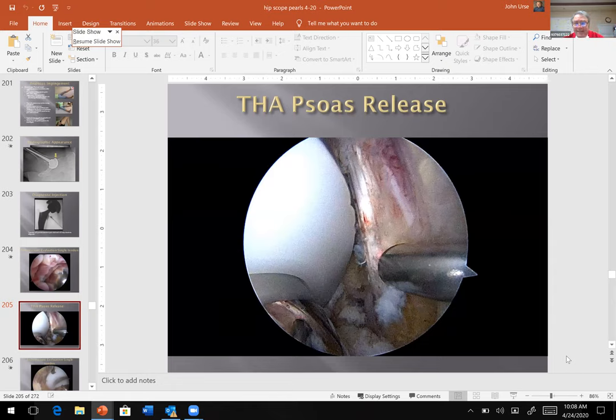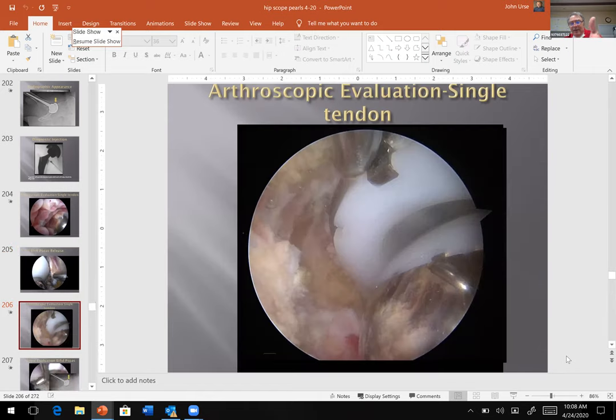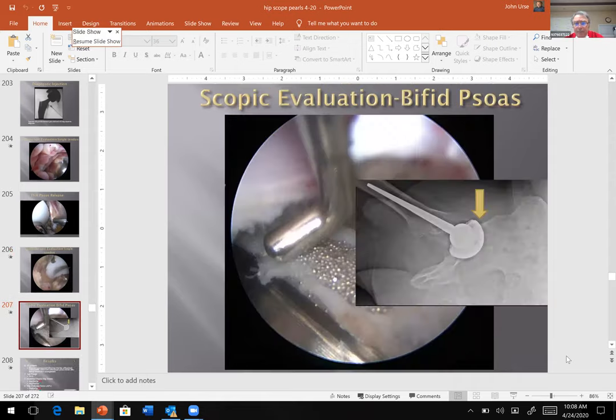And we go in and release these in the OR, and these people are just stupid happy. You can see the opening there on the left has now been relieved with a thermal wand. There's your femoral head, there's your cup. And you know this correlates to where that impingement is.